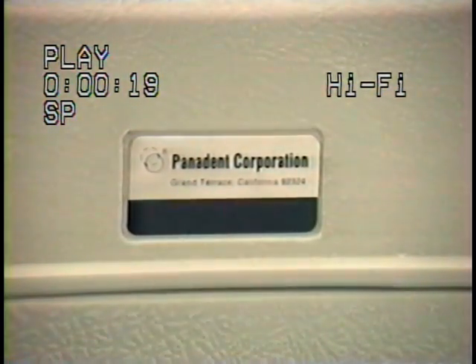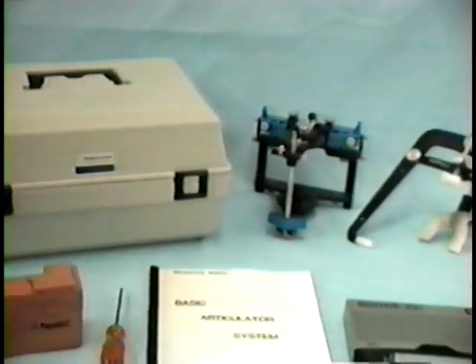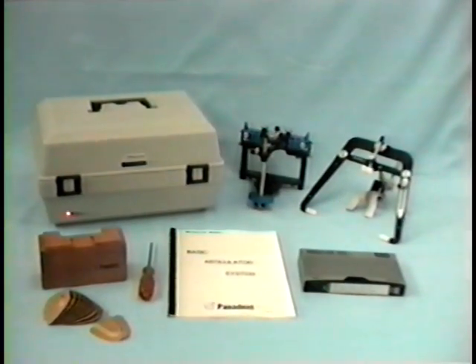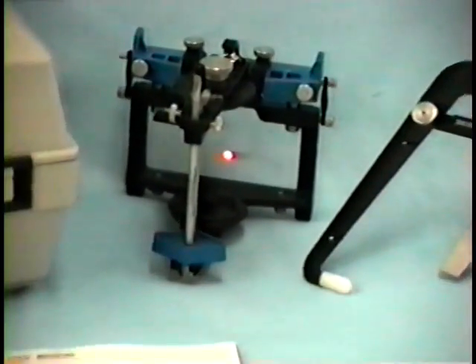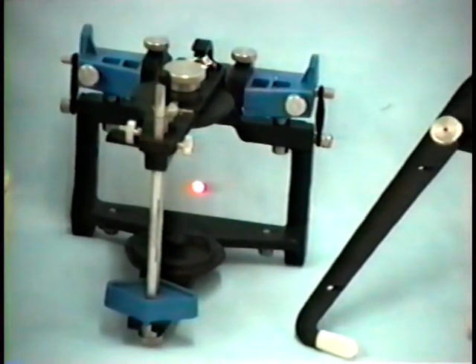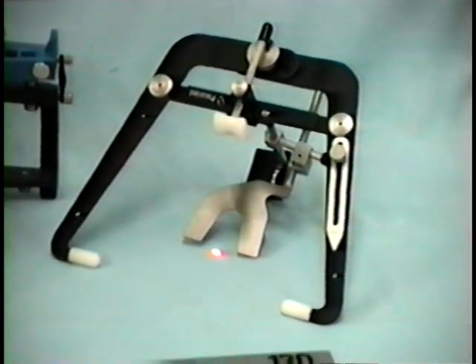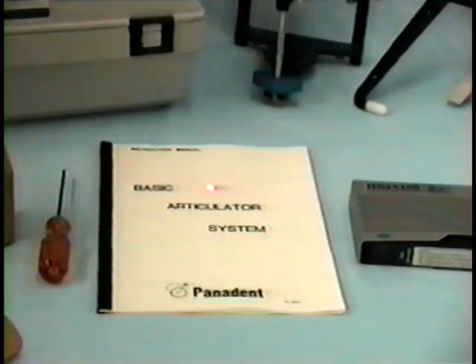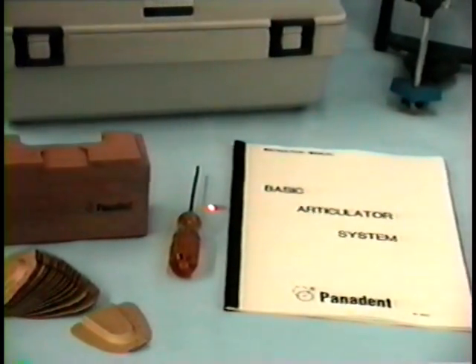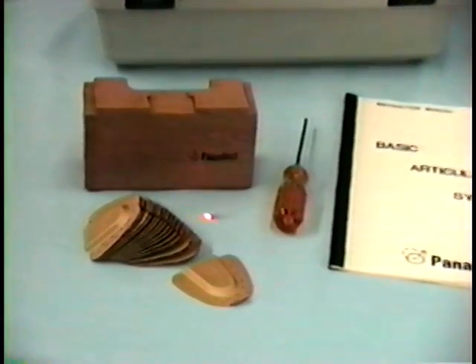Panadent Corporation presents our line of modular articulator systems. Shown here is the basic articulator system consisting of the carrying case, model SL articulator with 1.5 millimeter motion analogs, panel mount facebow assembly, videotape, and instruction manual. The hex wrench for adjusting the articulator and facebow, mounting block, and panabyte trays.